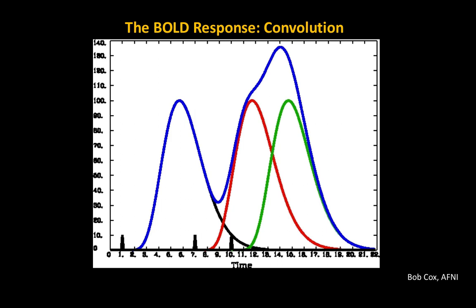Yeah? And there's a unique solution? Or there's a unique addition of basis functions that will produce the signal in that function? There's some error term, probably, but I mean, if you used enough, obviously. I think it's constrained by the actual number of directions that you collect, though. So you can't add more directions than you actually have to try to reconstruct the signal. But from what I've read from their papers, it seems to do a pretty good job at recovering the ground truth of what's going on.